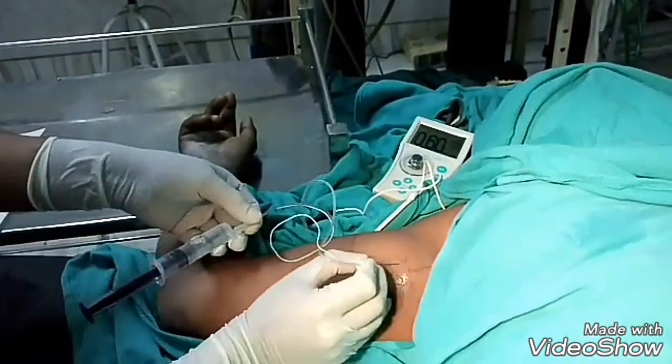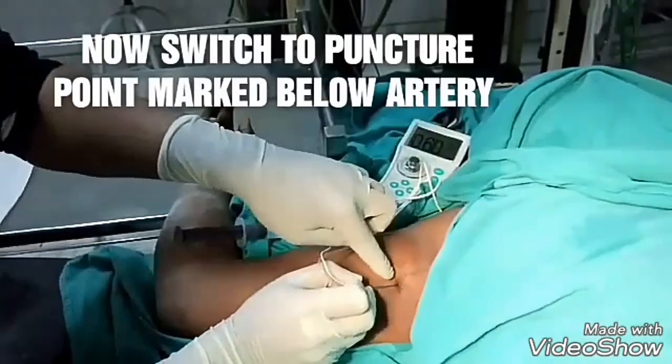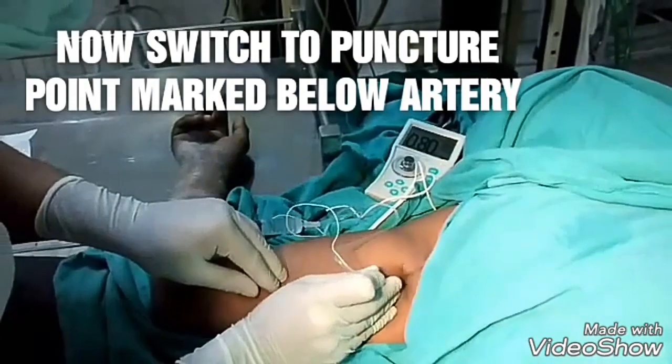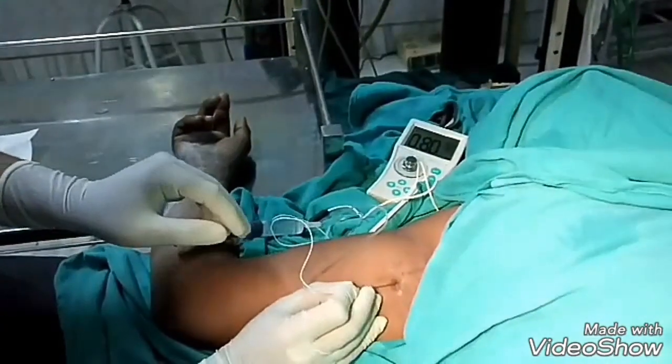Now come out and go at the second point below the artery — same thing, shallow angle — first we will go deep.